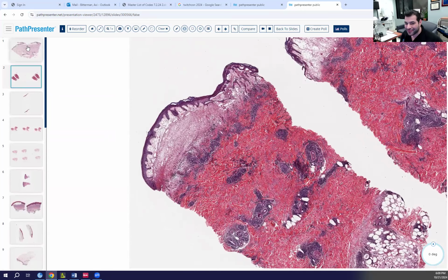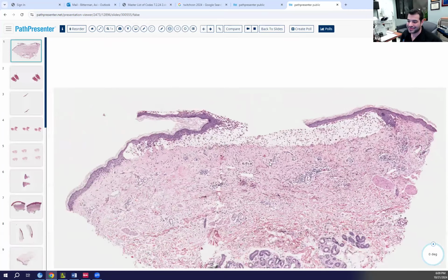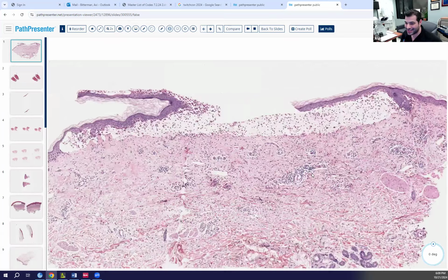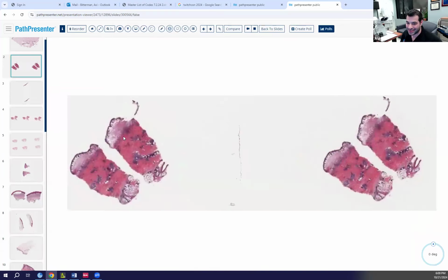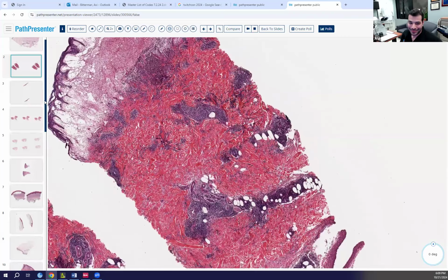And that's how it's very different from bullous pemphigoid. Burn this difference into the mind. This is your classic BP. This is your classic bullous arthropod. They both have EOs, but they are not the same.